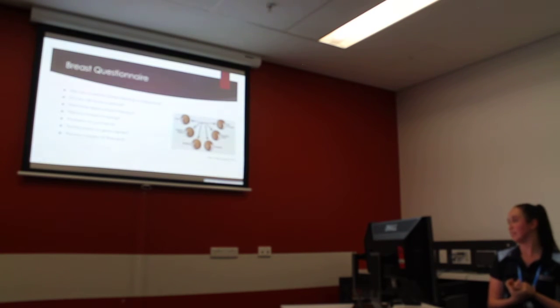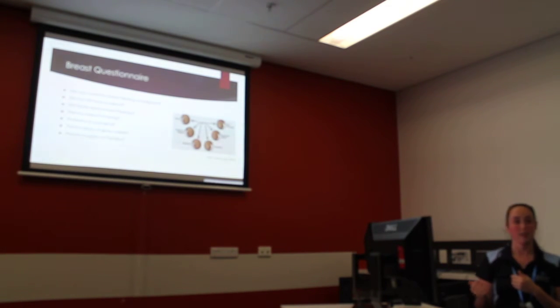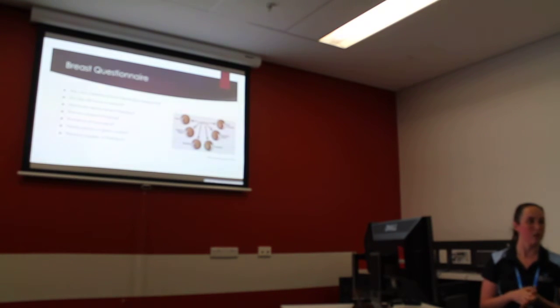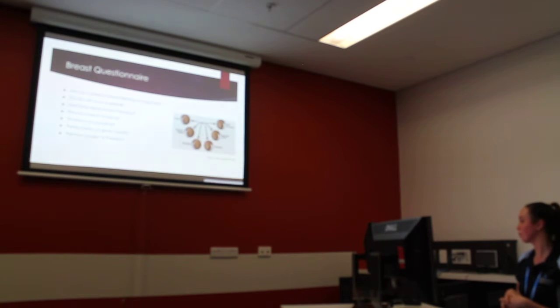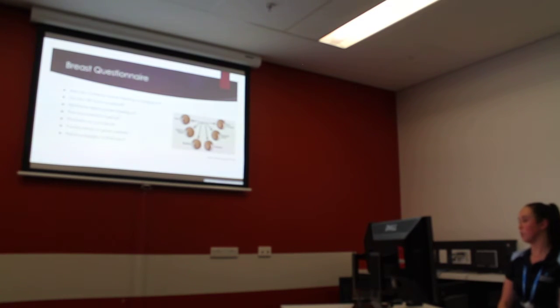Hormone replacement therapy can significantly impact breast density from the change in estrogen levels. Not all patients will remember what it is exactly that they're taking, but if you ask if they're taking tamoxifen or Femara, they may respond in accordance, and you can write down that one. So previous breast imaging is important. Again, comparison, having a baseline, seeing how they're being tracked. If the patient has any concerns such as scarring, lumps, discharge, dimpling, redness or skin changes, these should be recorded to help assist doctors in their future diagnosis.